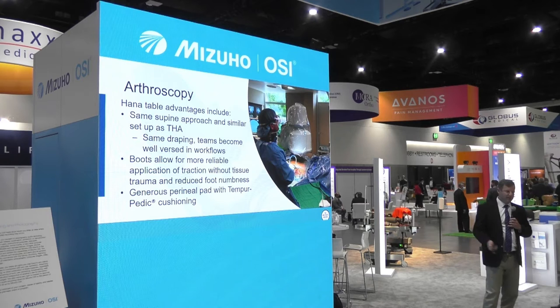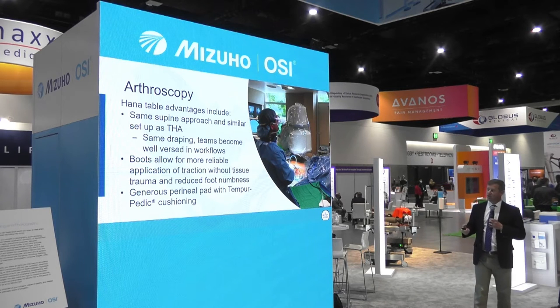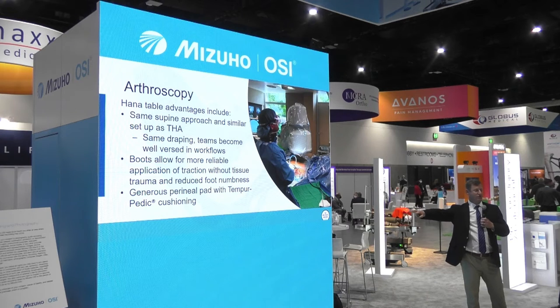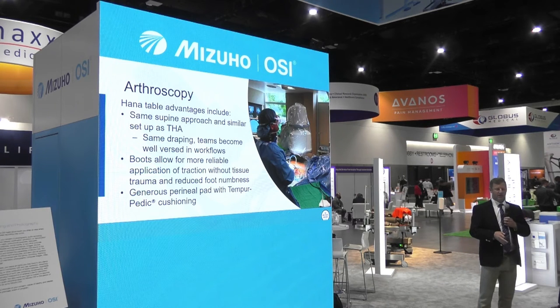So in arthroscopy, the Hana table has advantages. Specifically, you're using the same supine approach as your anterior approach hip. So typically my draping is pretty much the same. I have one standardized draping system that I use for all of my cases. My staff is very comfortable with it. They say, oh, it's Dr. Mast. We're going to pull these things for his draping.